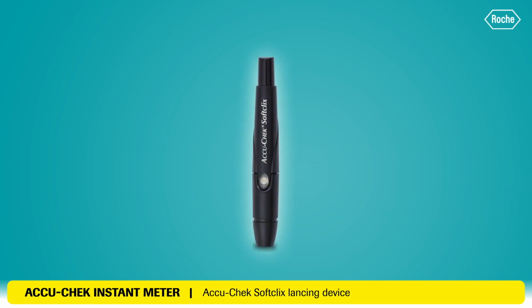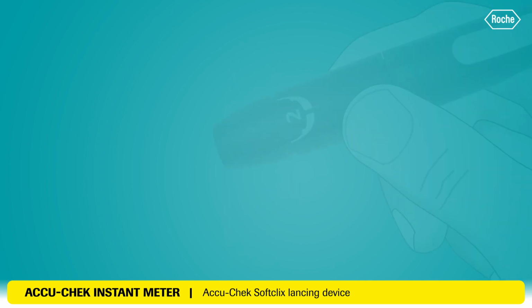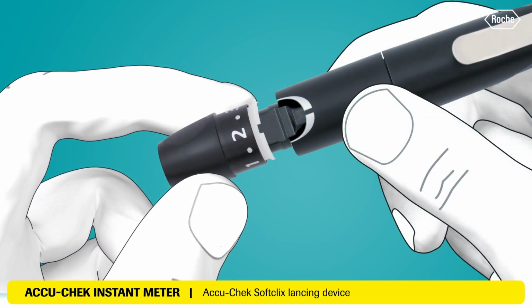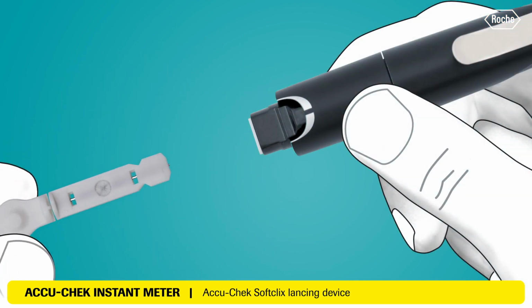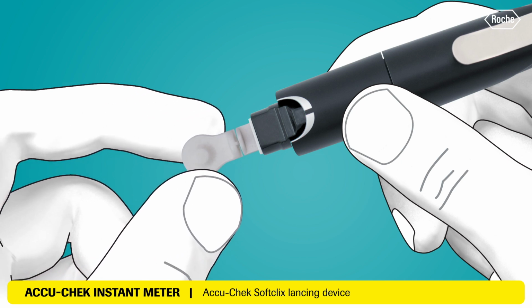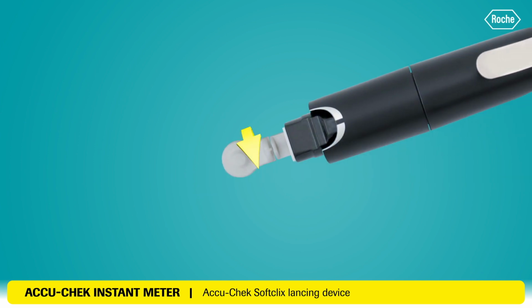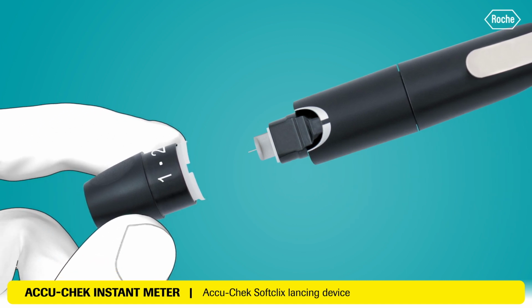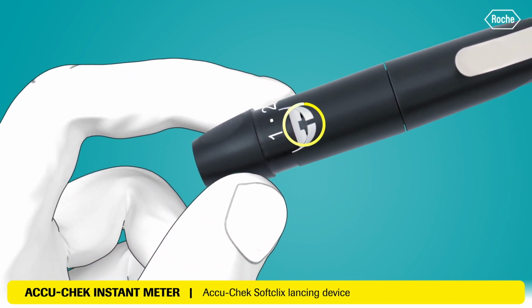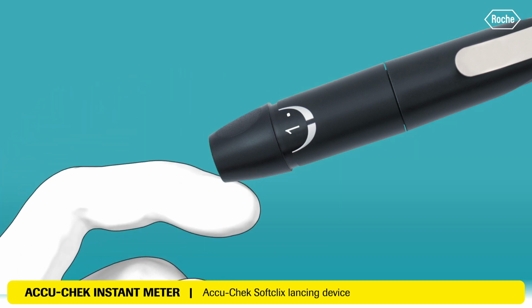First, you will need to load your lancing device. For this, you will need an Accu-Chek Softclix lancet. Remove the cap from the lancing device. Now insert the lancet into the lancet holder as shown. Push it all the way in until it clicks in place. Twist and remove the protective cap from the lancet to expose the needle. Place the cap back on your lancing device. Be sure to align the notch on the cap with the mark as shown.